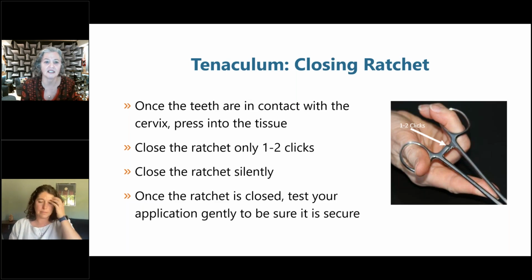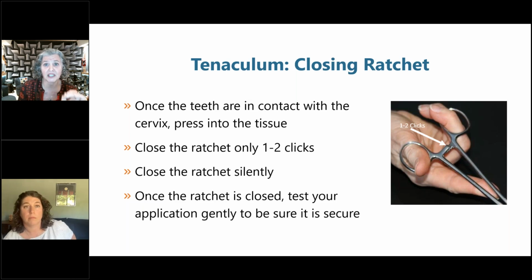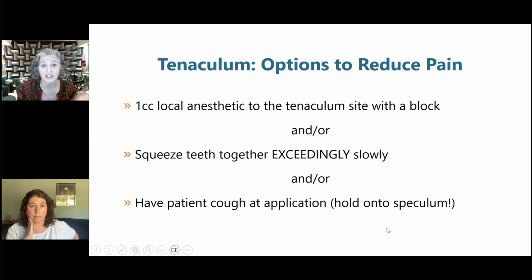So do that silently, and then check your application once you have placed the tenaculum to be sure it's not too narrowly placed, because it will tear through. And if it tears through, it's not the end of the world, but it's uncomfortable to have a second tenaculum placed a second time. So try to get a not too small, not too large bite, and check your purchase. We talked about the anesthetic.